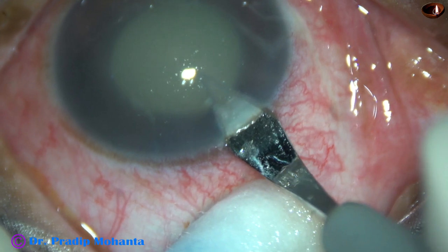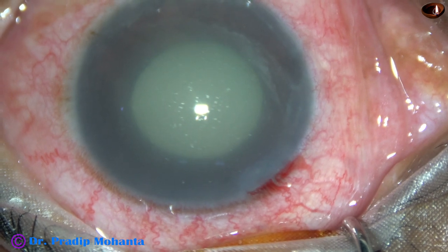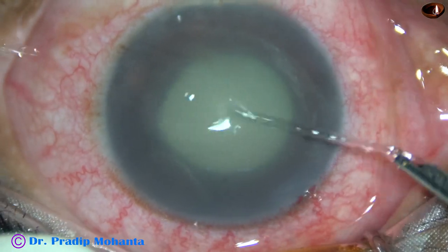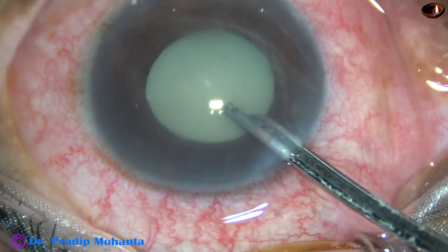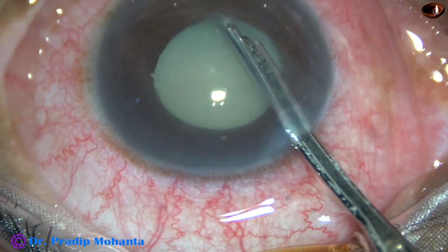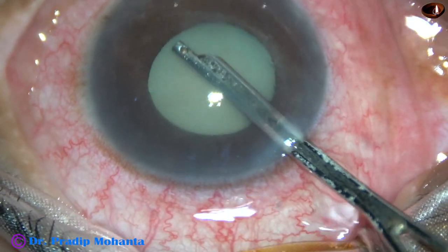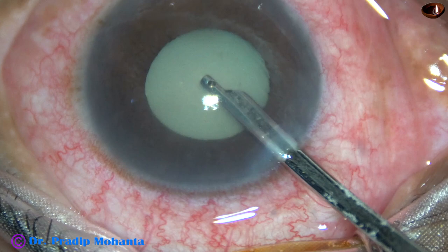This is the main incision with a 2.8 mm steel keratome. Now I take a 23G Simcoe cannula and aspirate the turbid aqueous. Lens matter has leaked out through the anterior capsule and the aqueous humor has become turbid. The turbid aqueous is washed out and now we can see the iris details clearly.